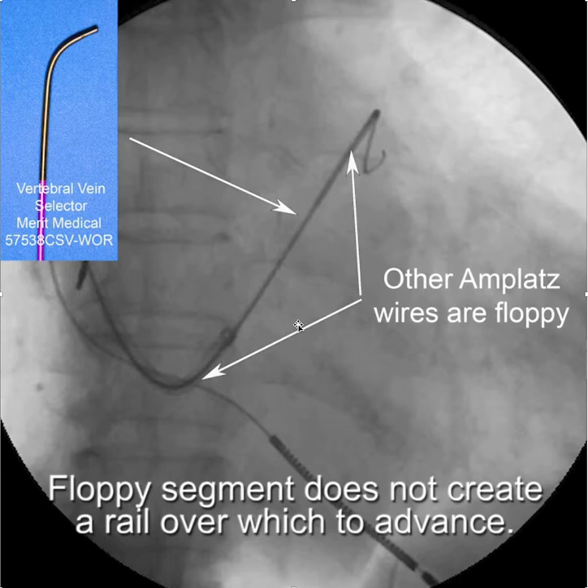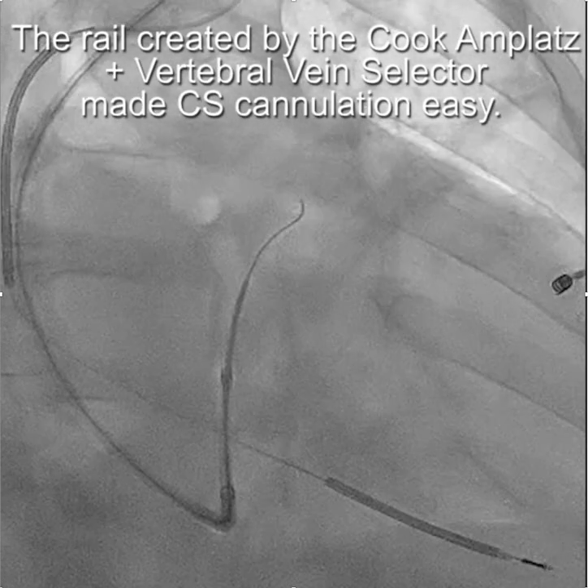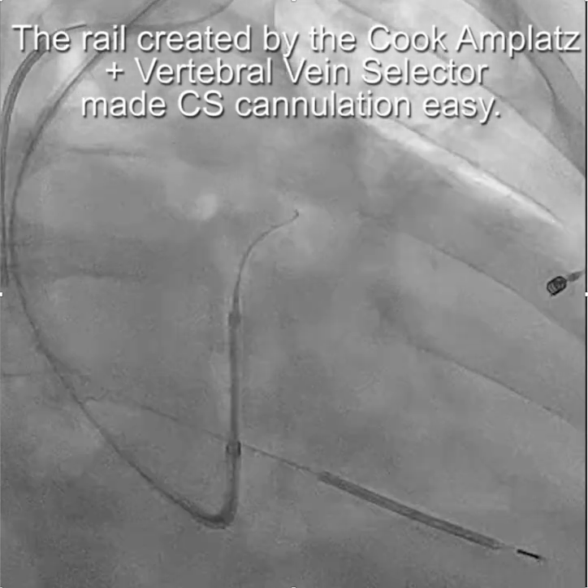If this was any other Amplatz wire, you'd only have a floppy wire inside the vein selector, which would not create a rail of any substance over which to advance your catheter. Going back to one of the original cases, this patient received an epicardial lead because of a tortuous CS that could not be cannulated. But the rail created by the Cook Amplatz and the vertebral vein selector combination made CS cannulation relatively easy, as shown here.